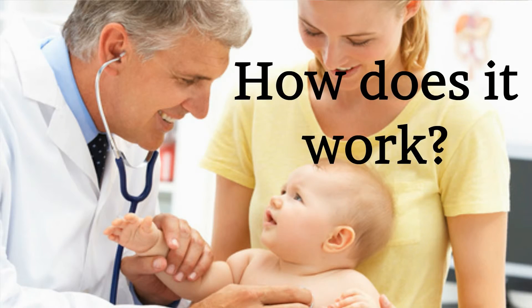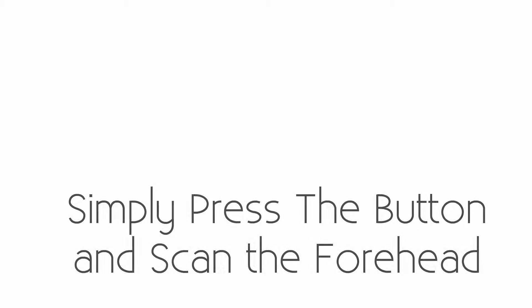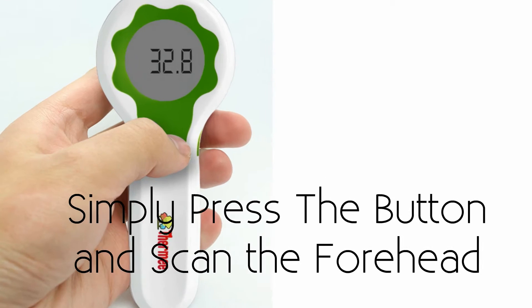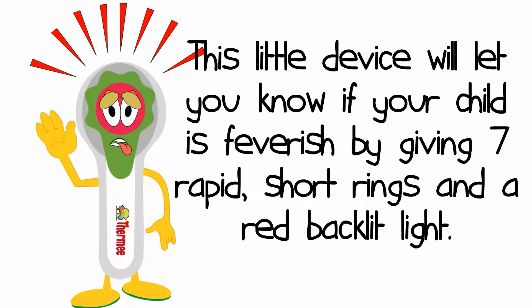How does it work? The forehead thermometer measures the infrared energy emitted from your child's skin. Simply press the button and scan the forehead from one side to another at a distance of one to six centimeters. This little device will let you know if your child is feverish by giving seven rapid, short rings and a red backlit light.